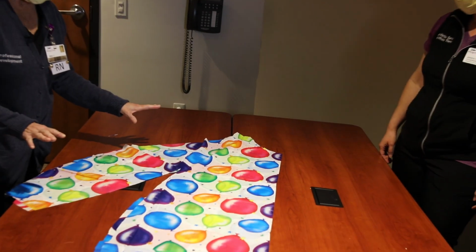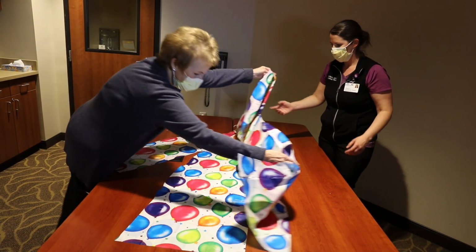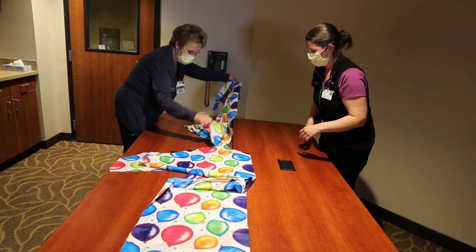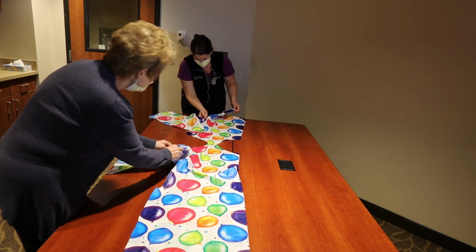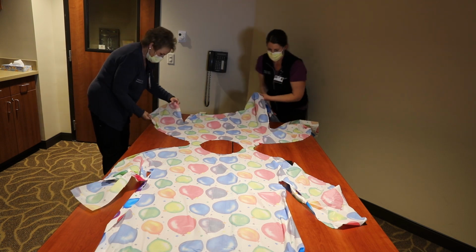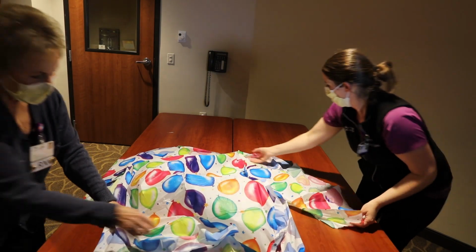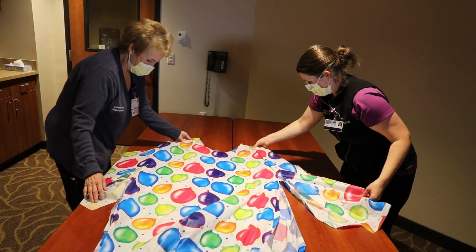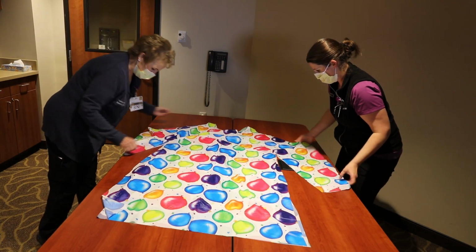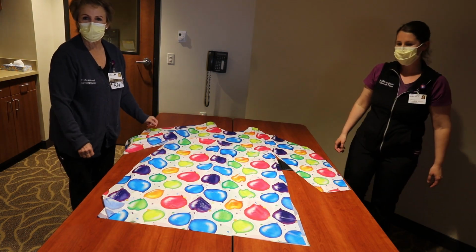Once it's cut out, it will look like this, but you must fold it and orient it the right way in order for the sides to be put together. So if you unfold it like this, and then what you'll need to do is to take the front or the back over at the shoulders and fold the front to the back, straightening up and aligning the edges, and then it will be ready to be put together front to back.